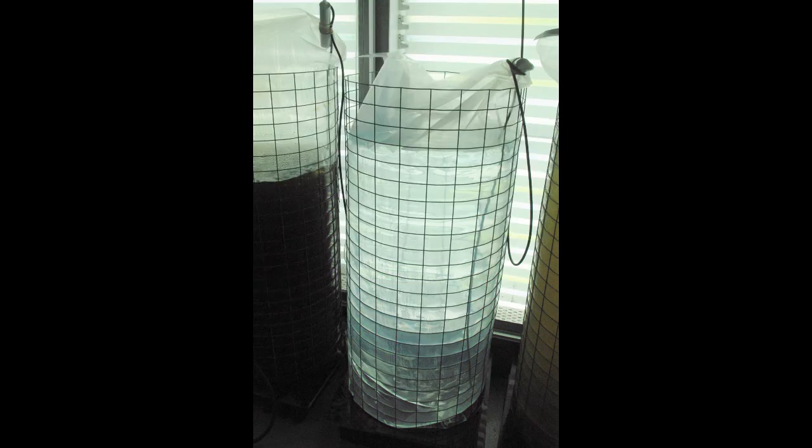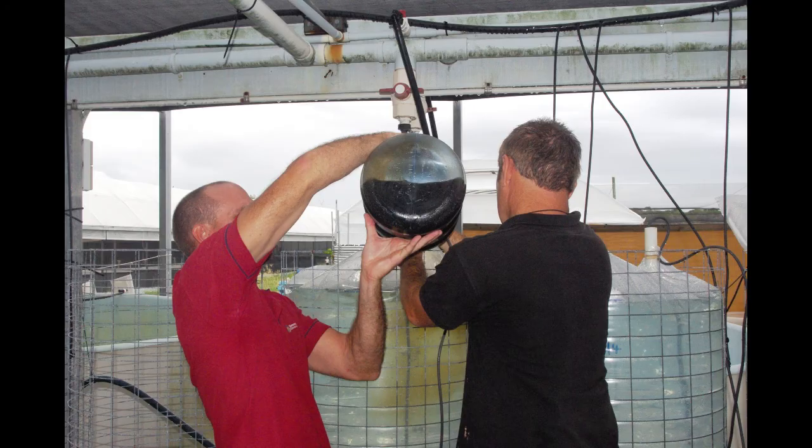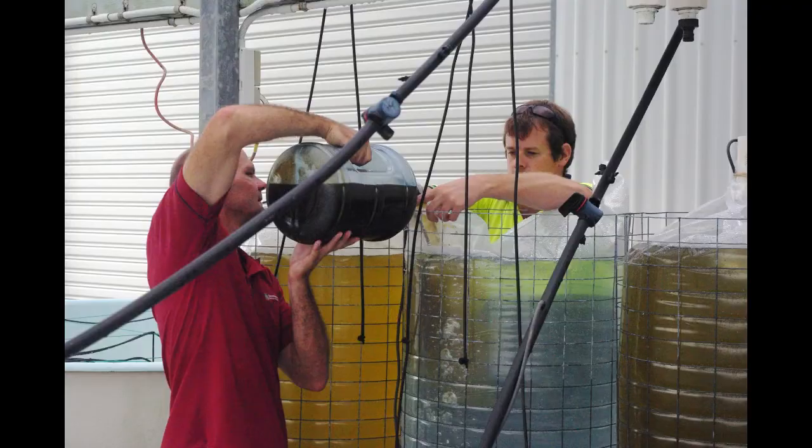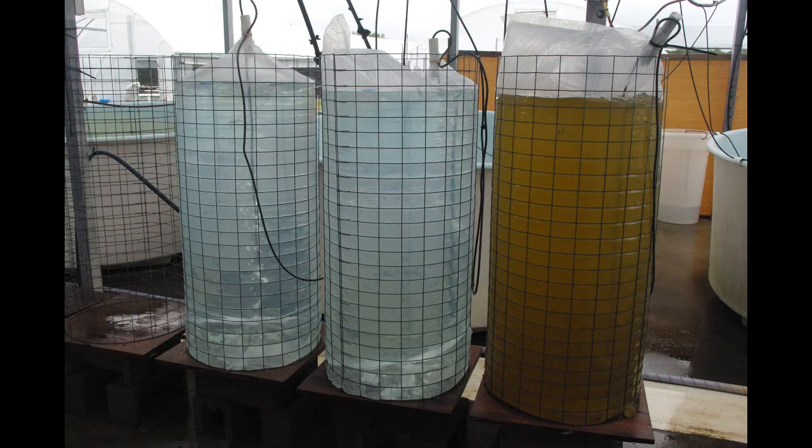The open area of the bag is then sprayed with ethanol and sealed around a PVC pipe with rubber bands. The PVC pipe is plugged with sterile cotton wool. A 10-litre carboy can be used to seed a 300-litre bag with TISO. The TISO can be poured directly in or siphoned with the aid of airline pressure.